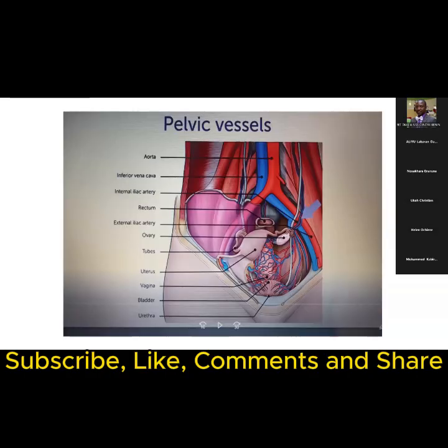Because the ovary might have a very variable location, it's important to always look for it where it's often located in the shallow fossa, just in the angle where the external iliac vessels separate from the internal iliac vessels. You've often heard of that shallow fossa called the ovarian fossa. That's often where you find it.